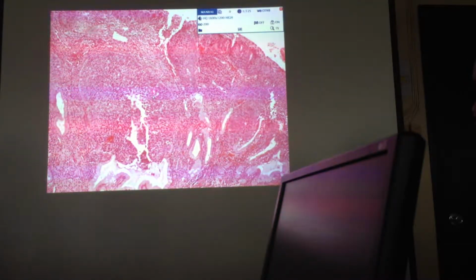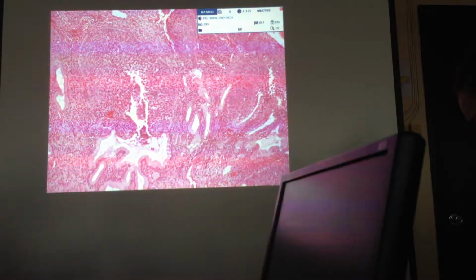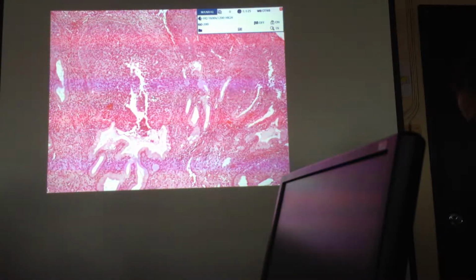Okay. This would mean that there would be an extension of the atypical cells towards the glands, and they would call this one a CIN with glandular extension. Okay, so this is not yet a sign of stromal invasion. So it is not a nest. You can see that there's still the presence of the basement membrane. Okay, that would be continuous with this cervical gland.